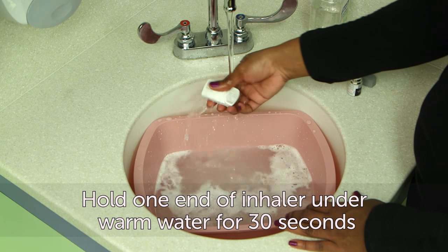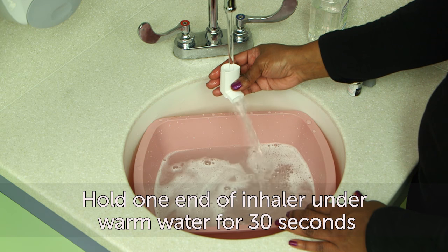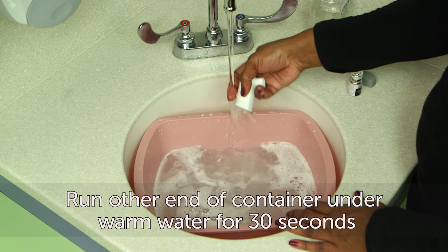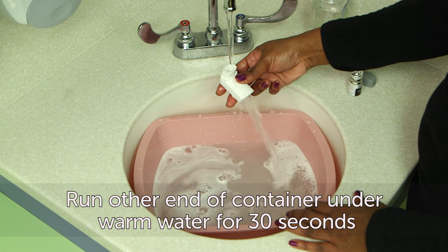Next, hold one end of the plastic inhaler container under warm water. Let the water run through the container for 30 seconds, then flip the inhaler container over and run warm water through the other end for 30 seconds.